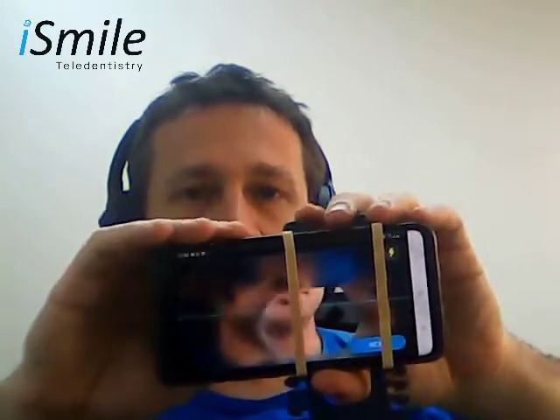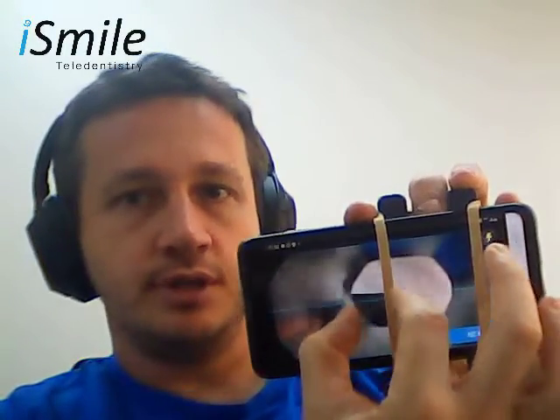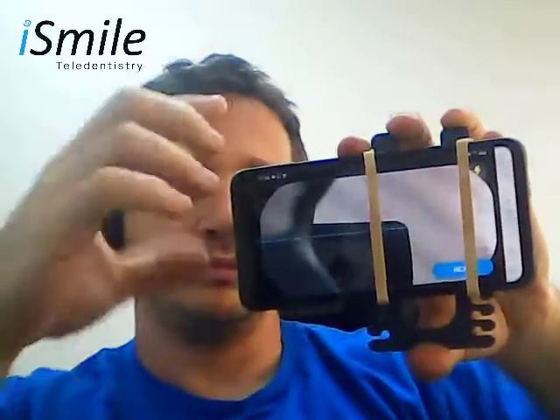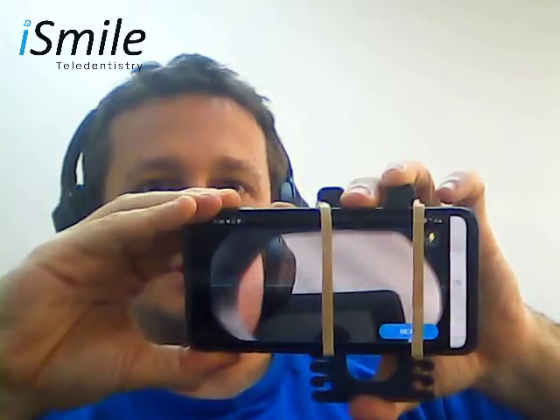Once again, you would like to position — you can nudge your phone around a little bit to position the opening of the scope to be in the center of the screen. Then use your fingers to zoom in such that the opening matches the dotted line going around the screen.